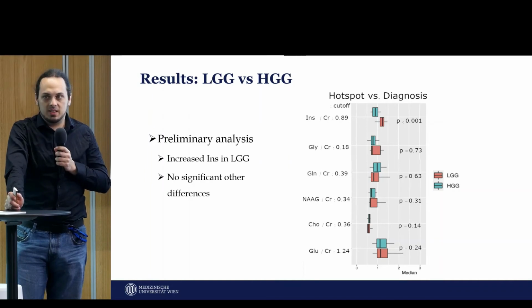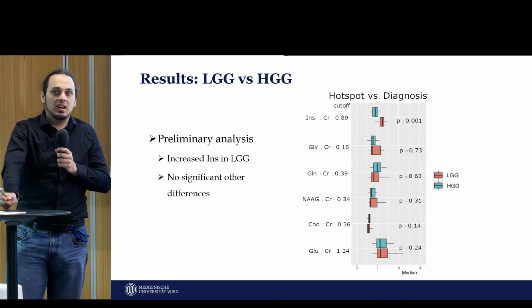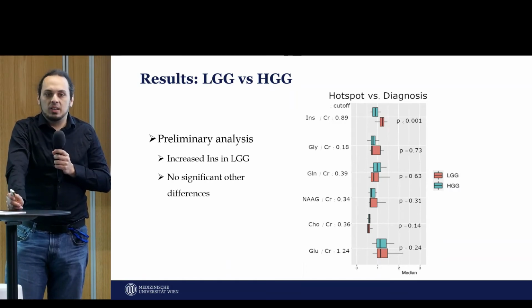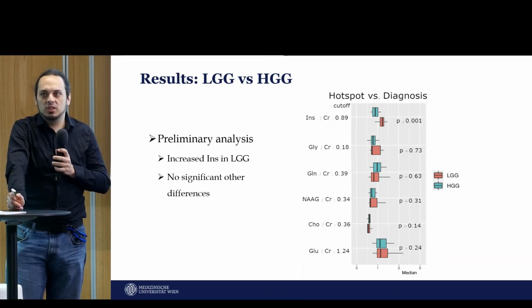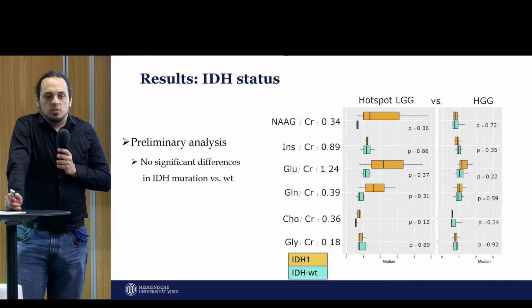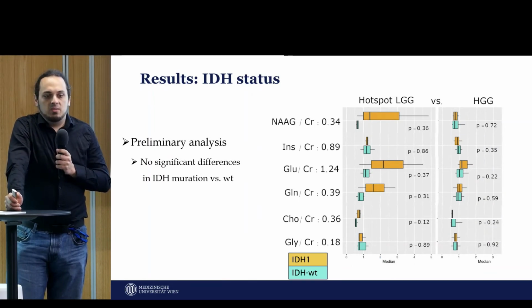We observed that especially for glutamine, some patients have really, really high values in the ratio to NAA, like in the range of glutamine to NAA of 10. Some are way lower, and our cohort is not big enough to really see if there's some specific mutations behind that. Also, for IDH, we found a few things that might be investigable.